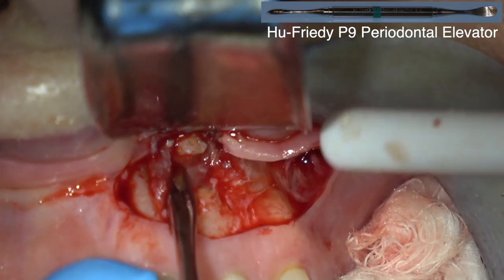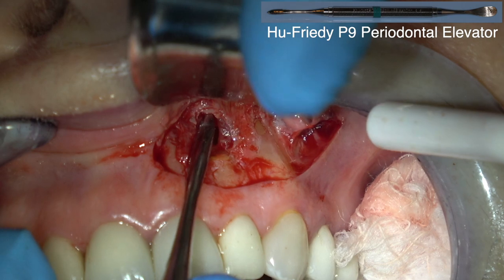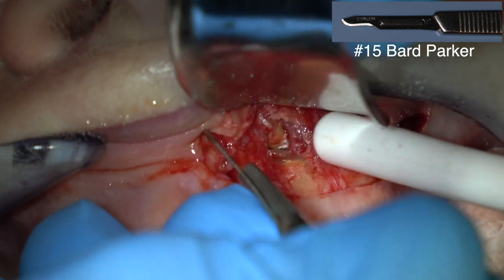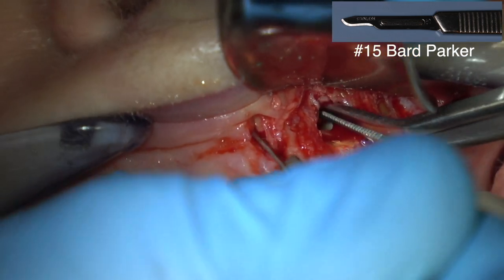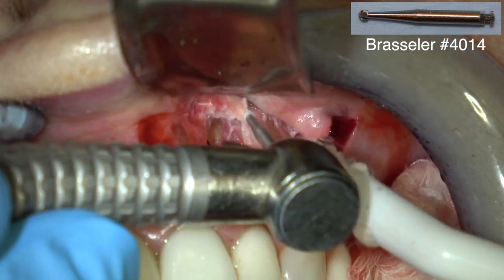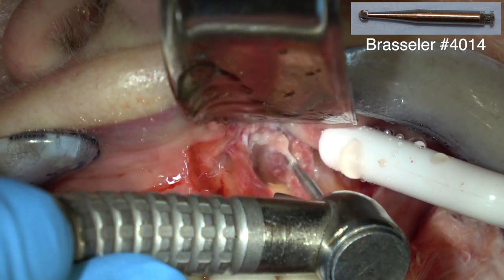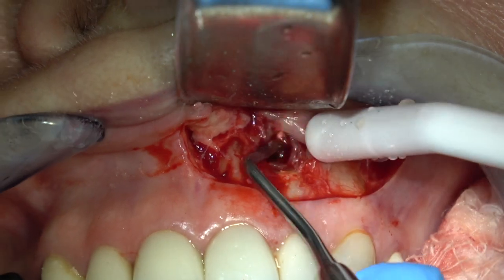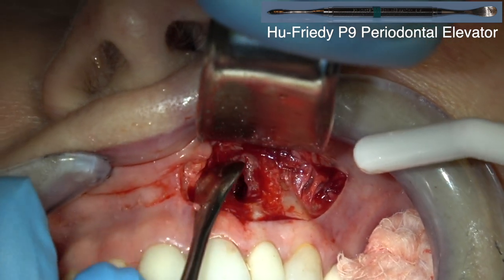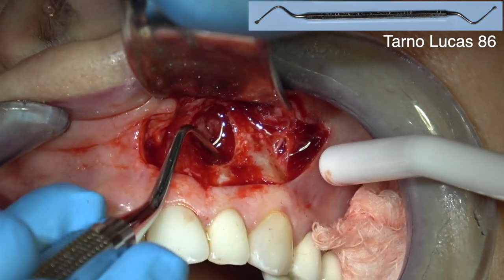Look at all that purulent exudate in there. The symptoms of this patient were just pain and achiness — she had a little fistula and she said it just aches all the time, I'm sure from the pressure of the purulent exudate. I'm extending my flap a little bit — this is a full-thickness flap. Since we're not doing anything to the cuspid and the central, you want to be sure you don't engage the roots of those teeth. Here's the tip of the tooth; now I'm removing that giant granuloma. Many times they'll come out pretty much in one piece — it's got a definite wall, and if you curette around that wall you can remove the entire thing in one piece.